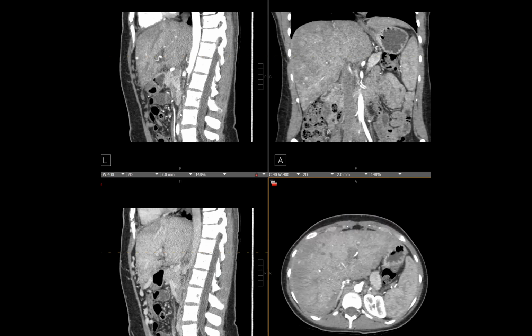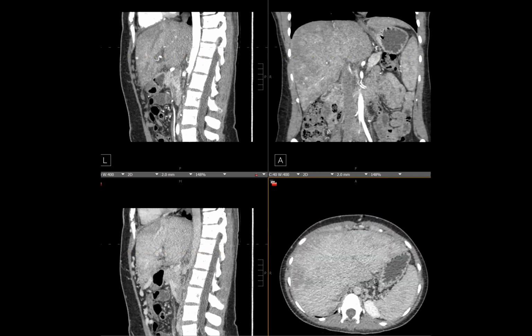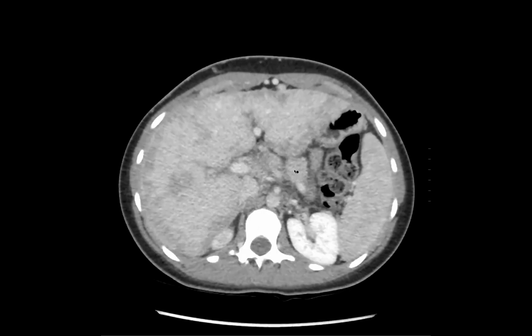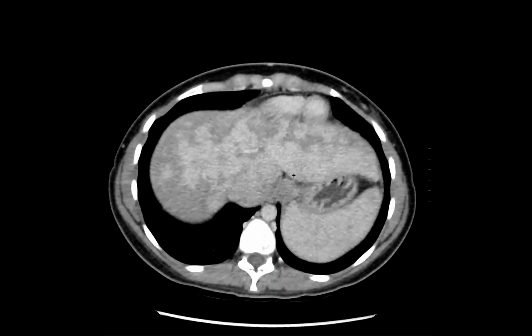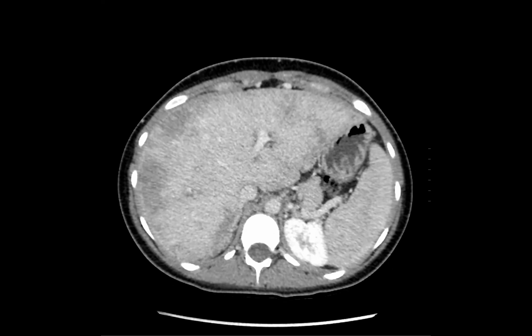This is a patient who has a history of, well, what do you guys think? What do you guys think about the liver? A lot of abnormal perfusion of the liver. Yeah, and what would you think about leading to this abnormal perfusion of the liver? Budd Chiari. Budd Chiari, yeah.